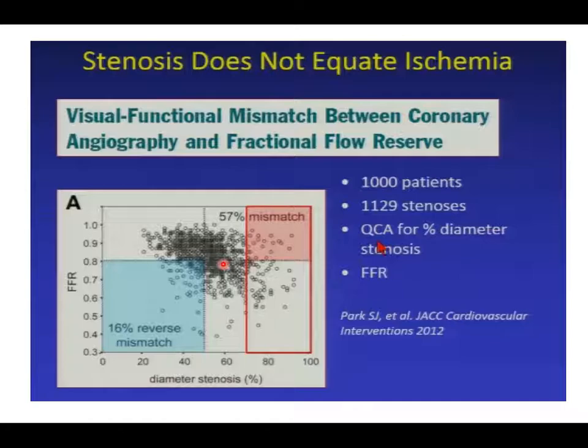not. I should note, just so that you don't think you just push this thing in and measure pressure, what you do is you push this catheter in and then you administer a drug, adenosine. Remember we looked at these stress agents? Adenosine dilates all of the distal vessel bed. It's supposedly a systemic injection of adenosine, but a lot of times they just inject the adenosine straight into the coronaries. And then, so now you've dilated the distal bed and you look at how that pressure changes.